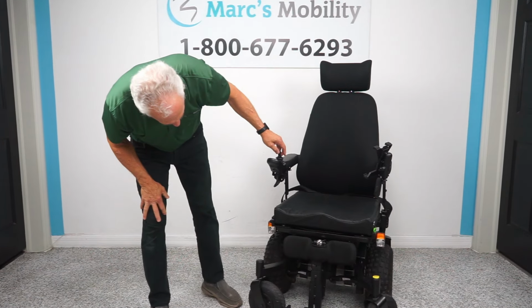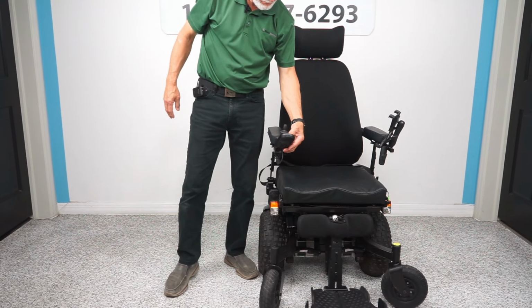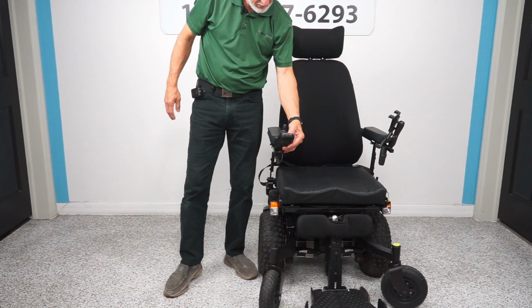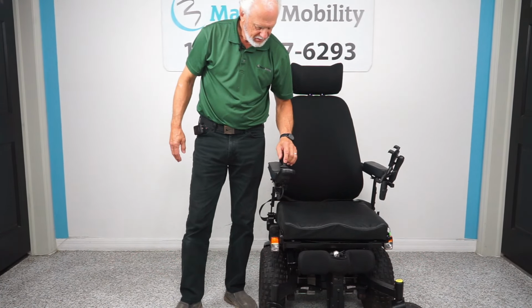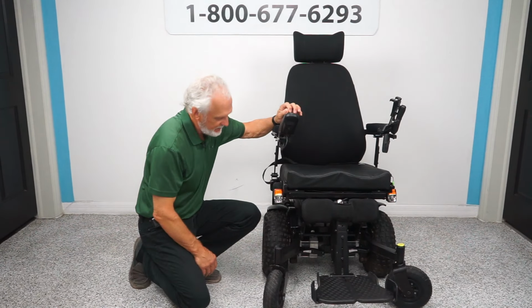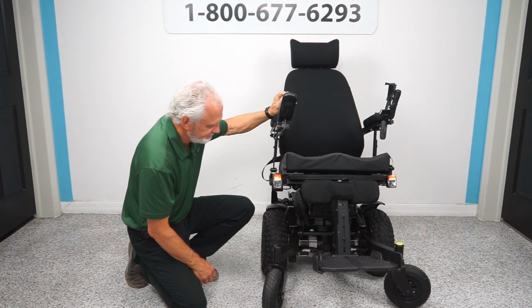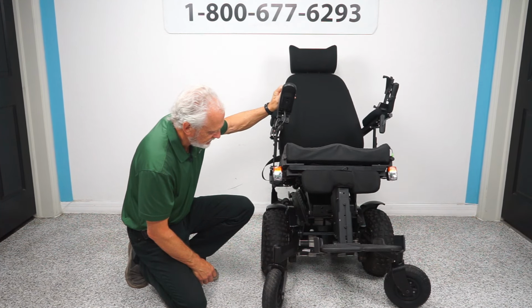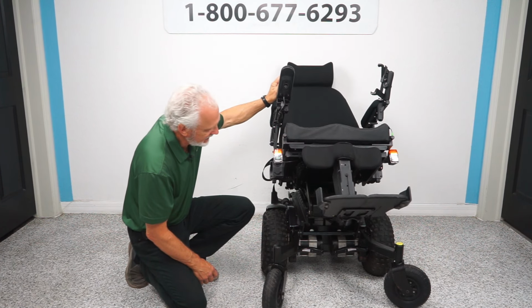If you look at the motors, well, let's see if we can do that better. What am I looking for? Ah, I had it. Tilt. I'm going to show you the motors, folks. I'm going to tilt the seat back. I think you can see the motors here.